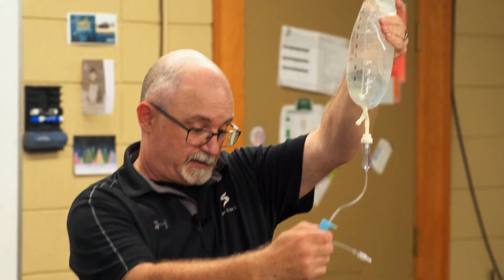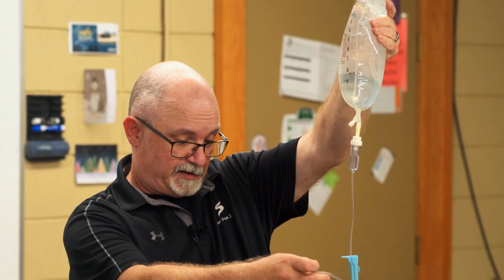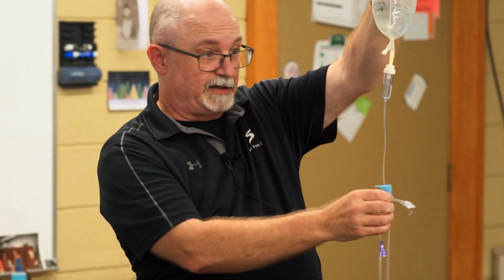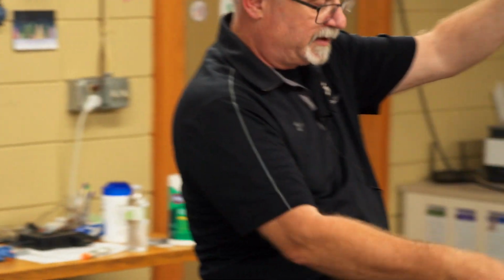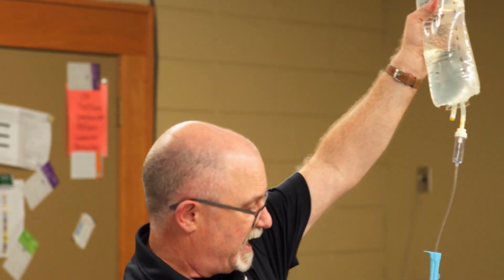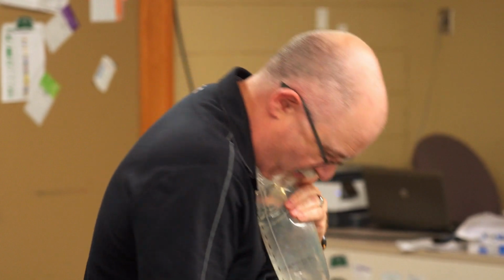But, all right, so I'm flowing. And there's a few little bubbles, no big deal. Again, those few little bubbles are absolutely no big deal at all. So we got a couple little ones in here. It's fine. Okay, so there we go. We've got the line flushed pretty well down. Let me do it again.